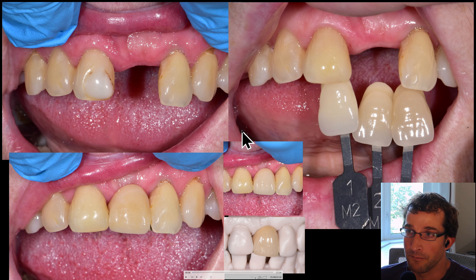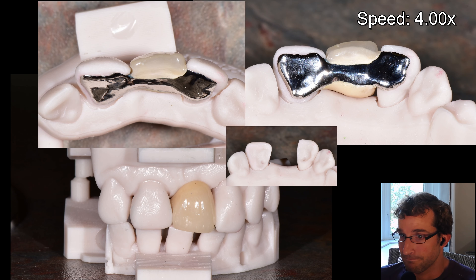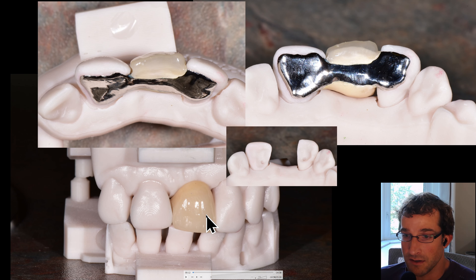So we did a Maryland here. I don't have the footage of the prep, but basically we got her back, replaced this unaesthetic filling on tooth 1-1 with some Fuji, prepped the lingual surface of teeth 2-2 and 1-1, then took a scan which I'll show, and sent a photo with some shade tabs. We got the unit back from the lab, which was a little bit too high in value, so we ended up staining it with Mio and installing it. This is the final result.